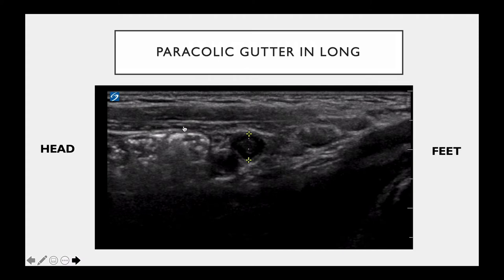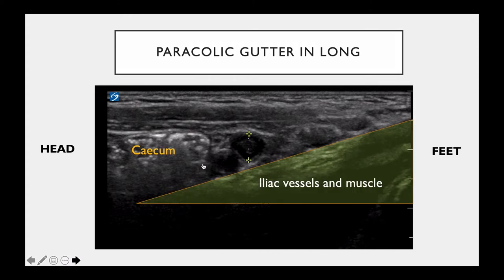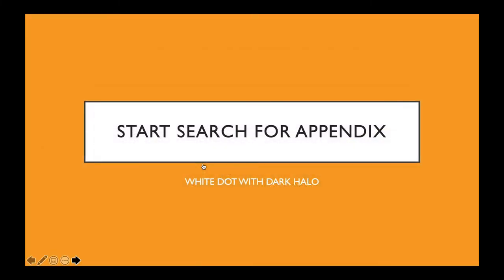You can see we have cecum here, the fluffy white cloud again on the left, and we have the iliac vessels and the iliopsoas muscle underneath, and we have the abdominal muscles on the top. So again, we only actually need to look in this small area. And what we'll be looking for is a white dot with a dark halo.